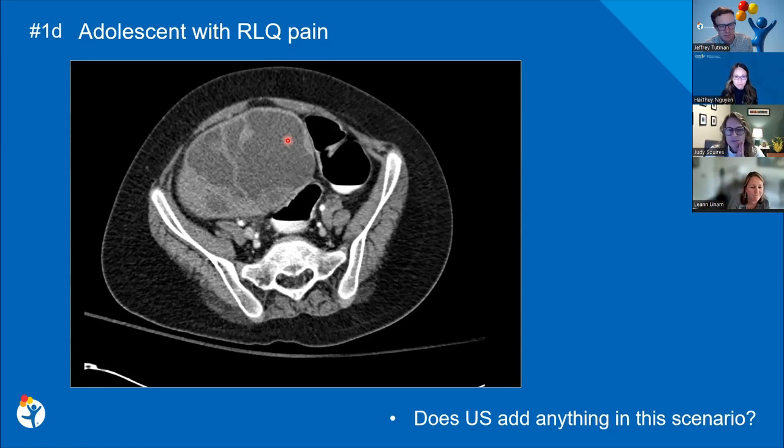I think there's this mantra in radiology lore that if it's female pelvis, you go to ultrasound. And I honestly think we probably don't need to get a subsequent ultrasound as much, especially when the preceding study was an MRI. I feel like MRI usually tells us more information than the ultrasound, and oftentimes, honestly, so does CT.